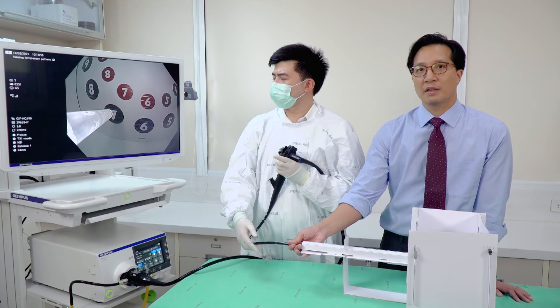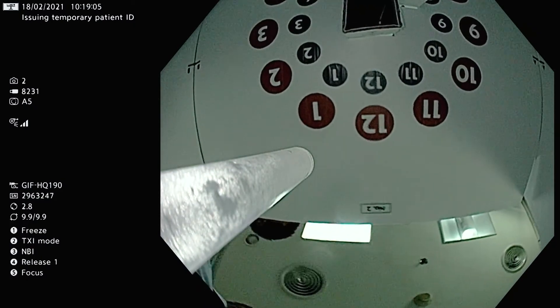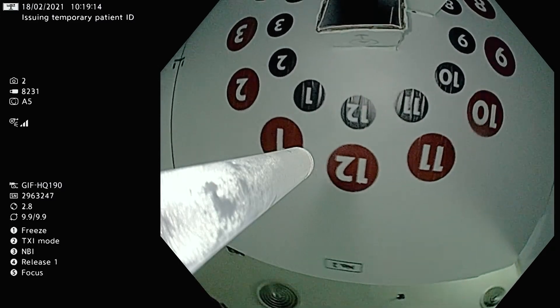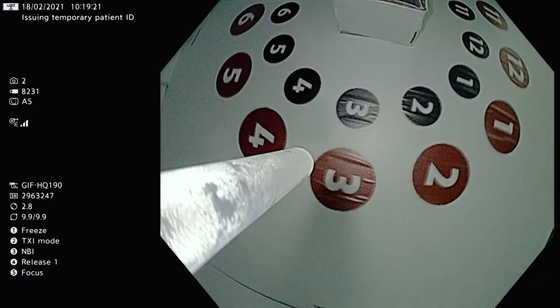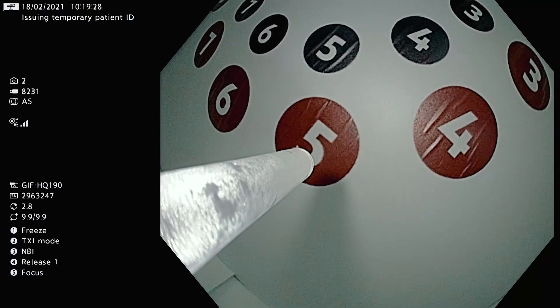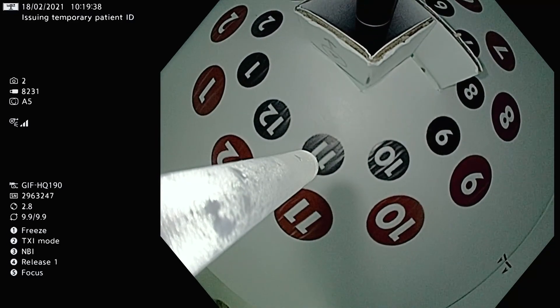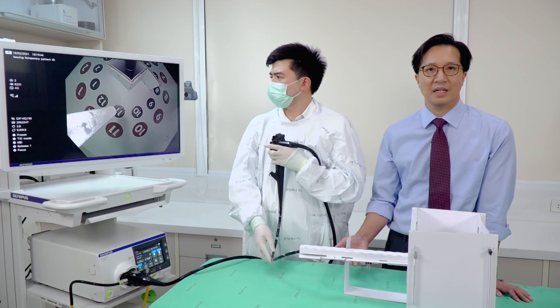We can also do this in retroflexion, which is useful for gastric varices injection. Here you allow the trainee to torque the scope and call back numbers. The red numbers are easier — for example, five red — then you go for eleven black, and so on. That's how you train the manipulation on the endoscope manipulation trainer.